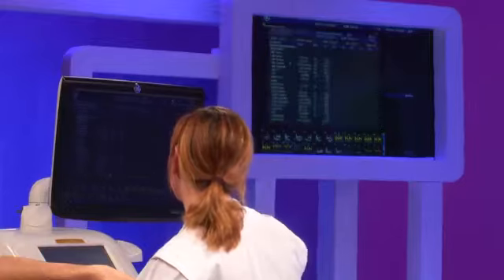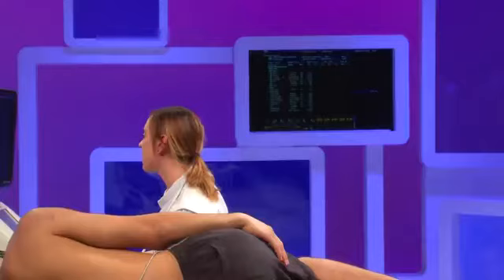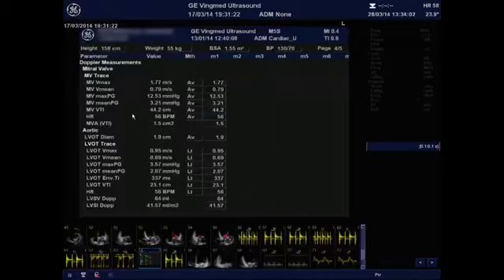So here you realize that we have all the parameters to calculate the effective valve area, which is 1.5 centimeters square. You need to compare that value with the reference value available in the literature. For a St. Jude number 27, you should expect a mitral valve area of 1.7 plus or minus 0.4. So you are in the range of normal value, and this is perfect.